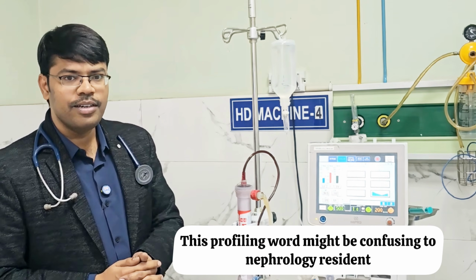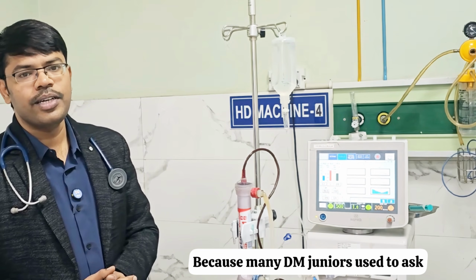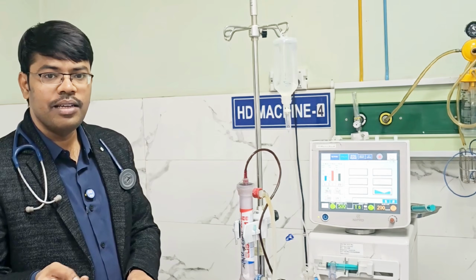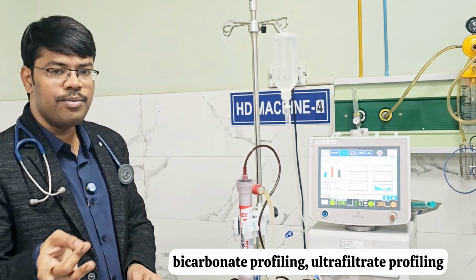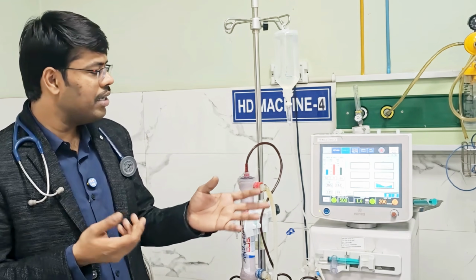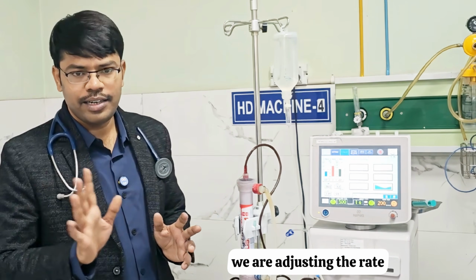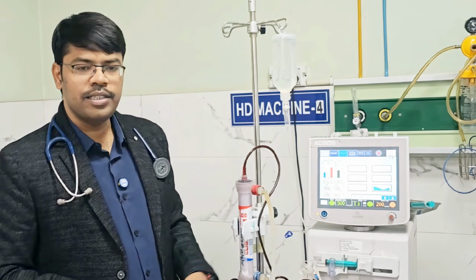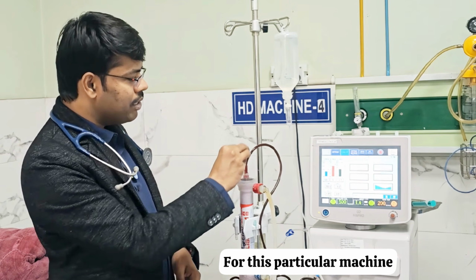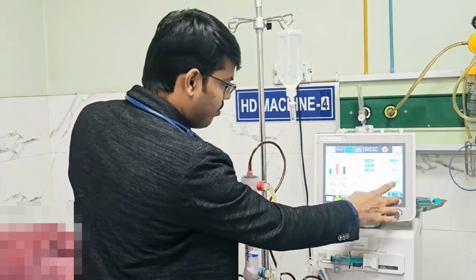This profiling word might be confusing to nephrology residents, because many DM juniors used to ask, sir, what is this profiling? You might encounter sodium profiling, bicarbonate profiling, ultrafiltrate profiling. Profiling is a word, I feel, that is a word to confuse only. The concept is, according to the time, we are adjusting the rate. Is the graph fixed? The question will come, is the graph fixed? For this particular machine, only these 6 graphs are there or what? No, you can adjust this also.